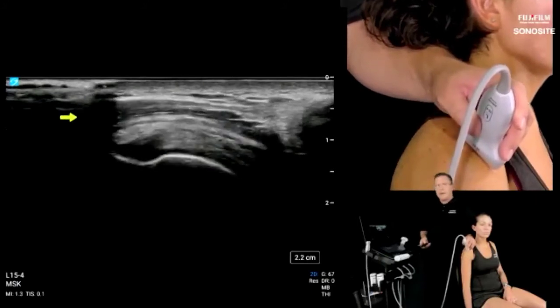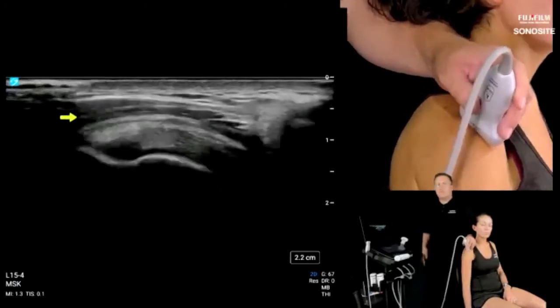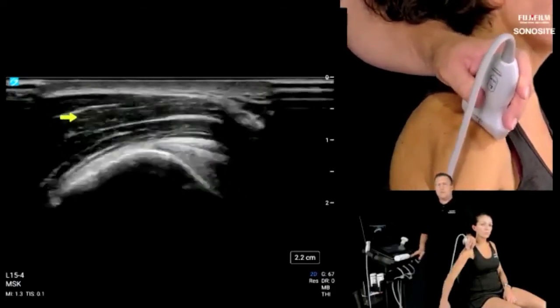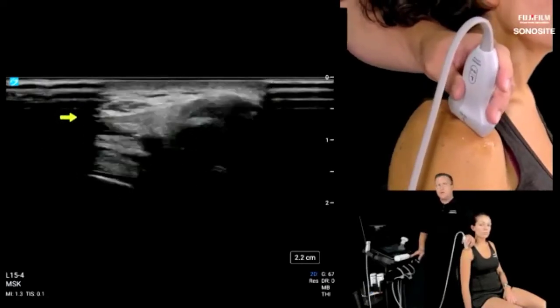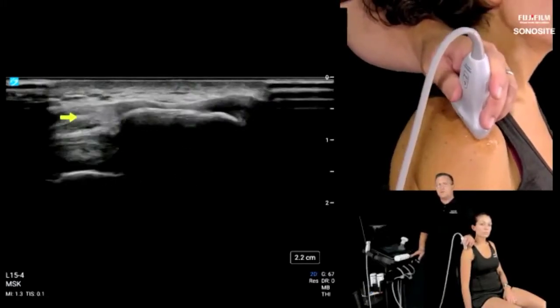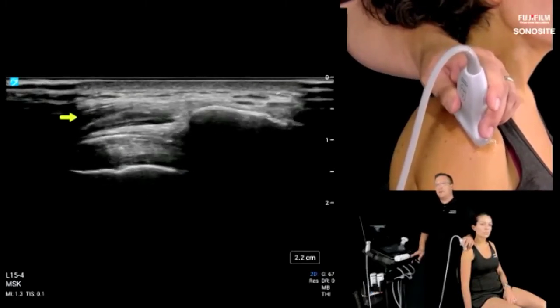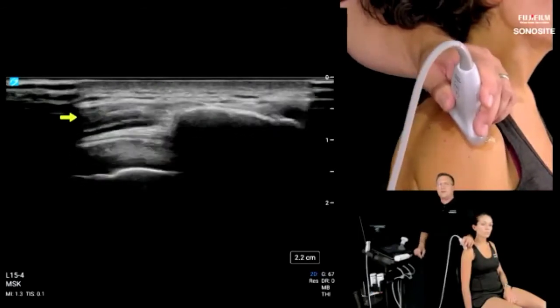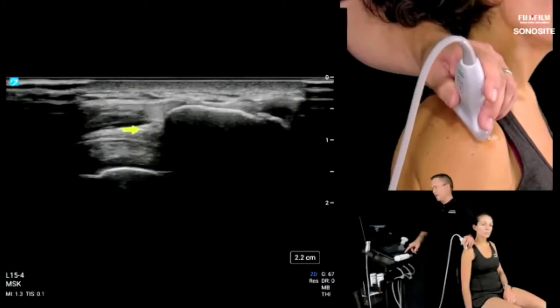And another thing that can happen is the pressure from the transducer will get translated through the deltoid and collapse the subacromial bursa. So if you place the weight of the probe on the acromion, you eliminate the pressure that the transducer puts on the bursa. So we don't want to deflate the bursa if it's going to be inflamed and inflated with fluid, right? So put the weight of the probe right there on the acromion that we're seeing here on the screen, and then do the abduction.